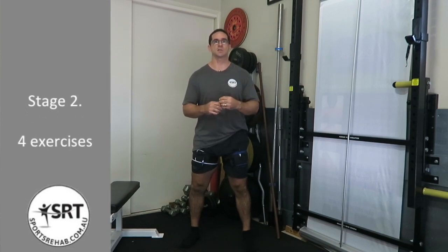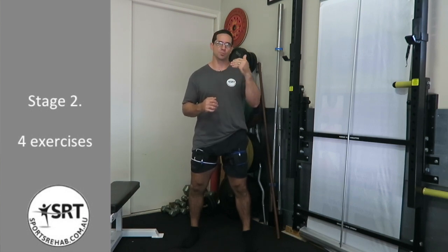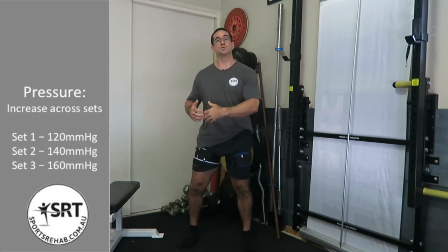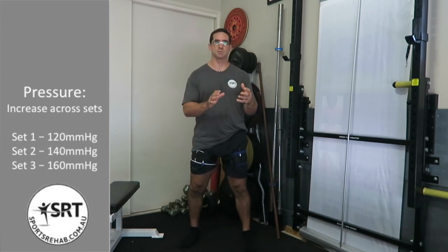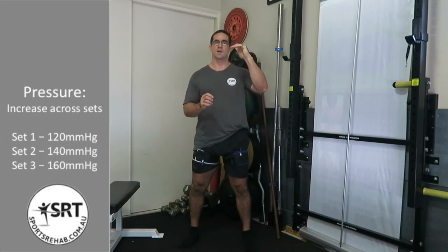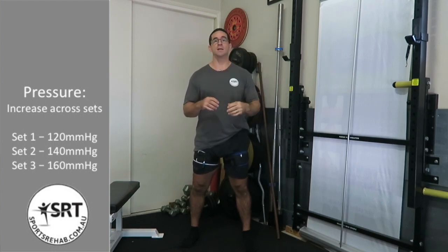Part 2 is in a standing position, and this is what I would typically do. This consists of 4 different exercises. With this type of protocol, I'm going to do 3 sets and use incremental pressure. Remembering I'm doing this first thing in the morning, I've woken up, I'm a little bit stiff. So I find my typical training pressure, which is 50% of arterial occlusion, which for myself is 180 millimeters of mercury. I'll use an incremental pressure of 120, 140, then 160. I'll never go up to 180 because I still find I'm able to get an analgesic effect from this type of exercise.